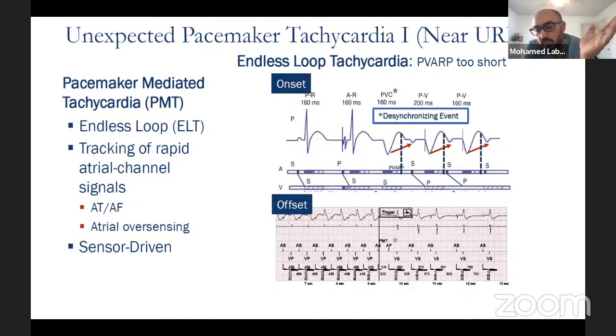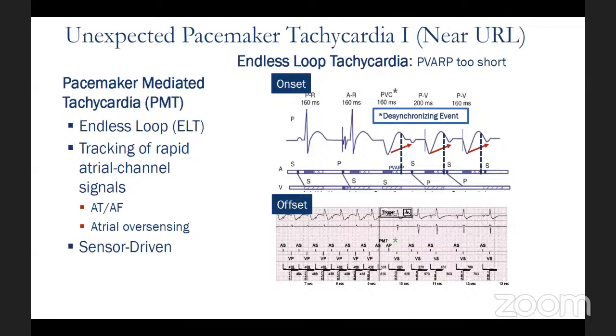Yeah, the scenario that I described is where you're not sure. In that situation, it's reasonable. I don't think one approach or the other is wrong. It comes down to clinical judgment, and I agree with Khalid that you should have a committee of physicians who do the same work and talk to them. Dr. Fathi brought up a very good point about using CMR in those cases. In your clinical judgment, if you don't think this myocardium is viable, then like what you said, Yusuf, you don't have to overthink it.